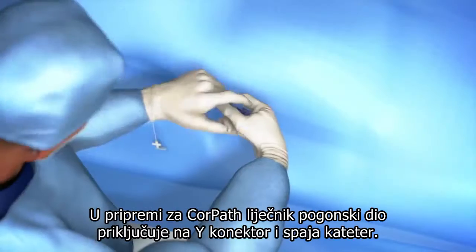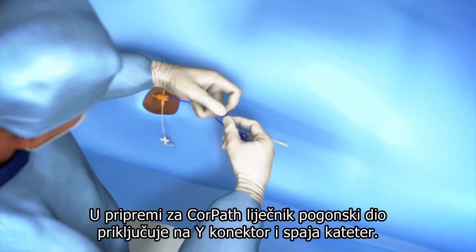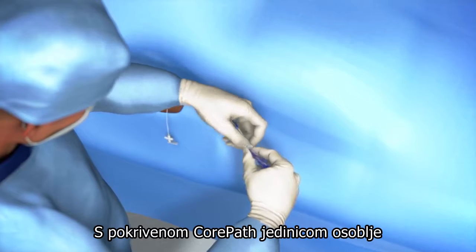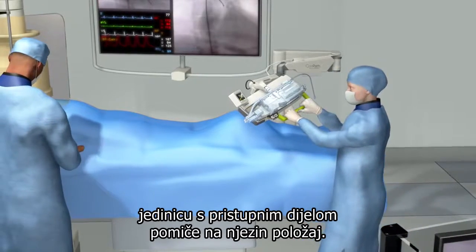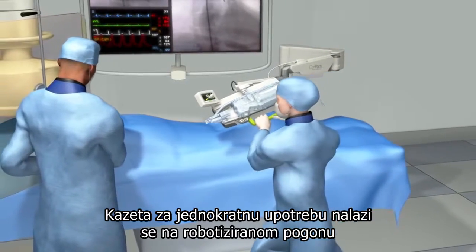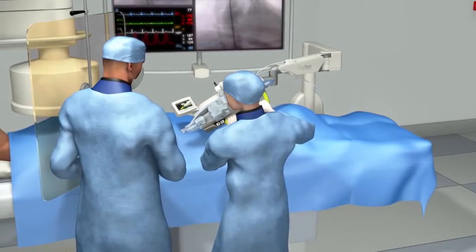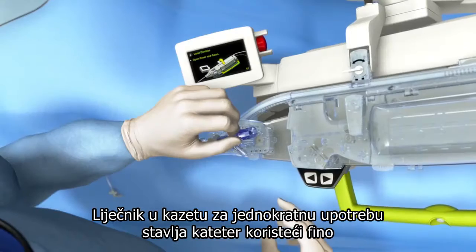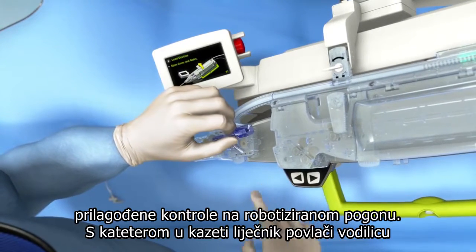In preparation for CorPath, the physician attaches the drive gear to the Y connector and then connects the guide catheter. With CorPath's bedside unit draped, the scrub staff employee moves the extended reach arm into position. You can now see the single-use cassette mounted on the robotic drive, which is where the interventional devices will be loaded. The physician loads the guide catheter into the single-use cassette using the fine-tuned controls on the robotic drive.